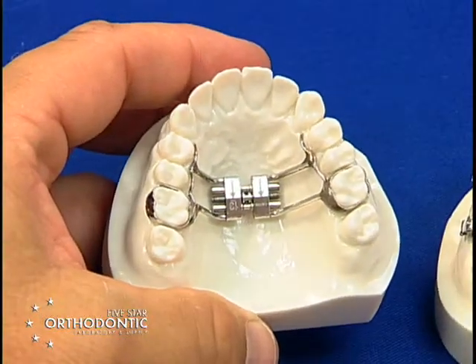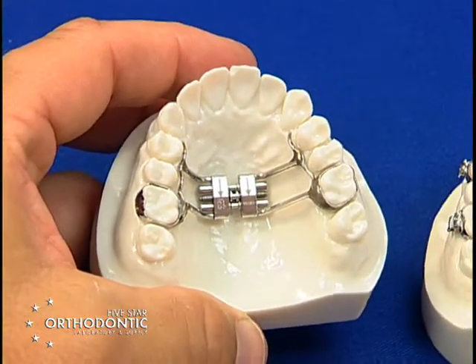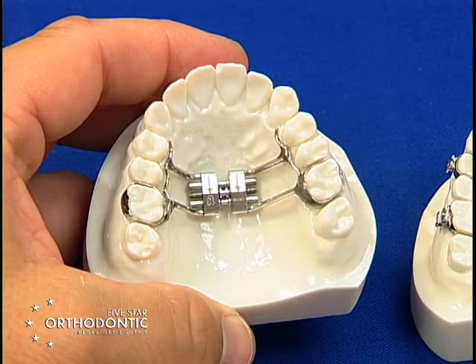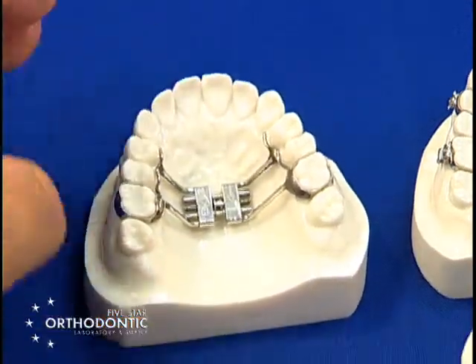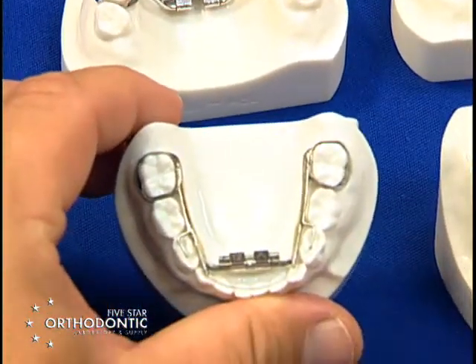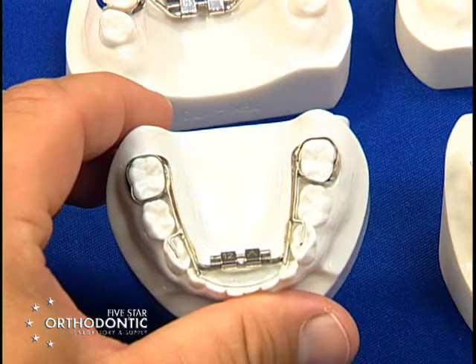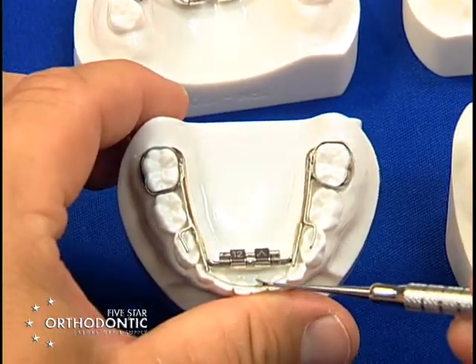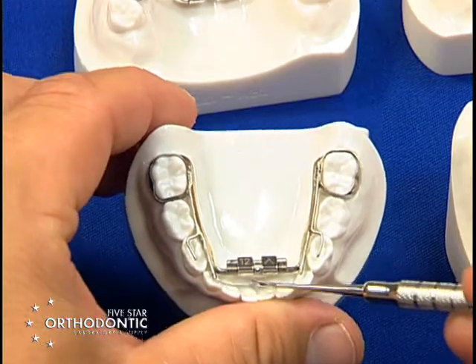This is an upper RPE, commonly known as a hyrax. This is used for transverse development only. You have a lower Williams appliance that is also used for transverse. You also have a NITI wire that is set into hollow tubes that will straighten lower incisors.